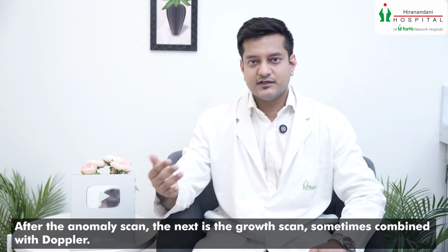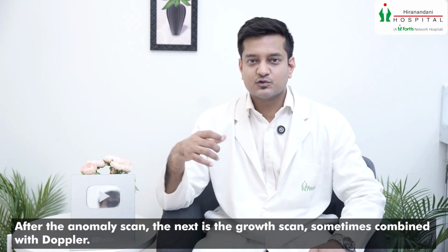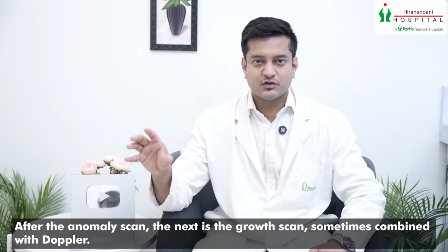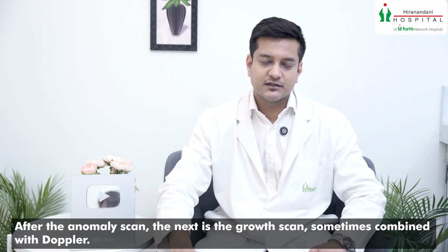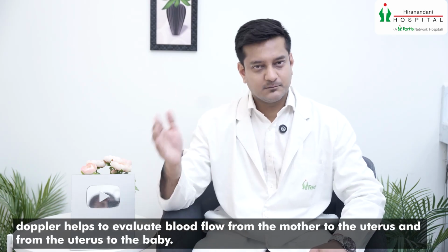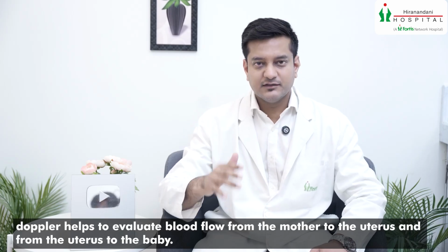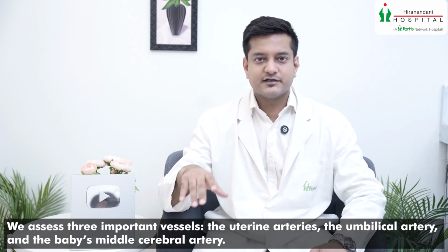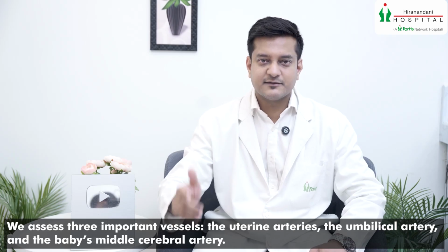After the anomaly scan, which is the most important scan of pregnancy, the next scan is the growth scan or Doppler. Based on the baby's development, a normal growth scan, or along with the growth scan, additionally a Doppler can be done. Doppler is important to see the flow of blood from the mother to the uterus, then from the uterus to the baby. So predominantly 3 arteries are seen: the uterine arteries, the umbilical artery, and inside the baby's brain, the middle cerebral artery.